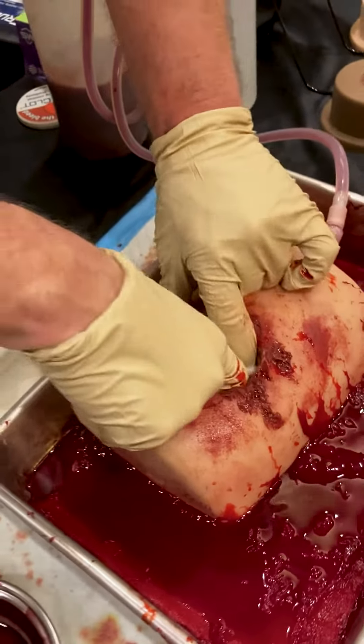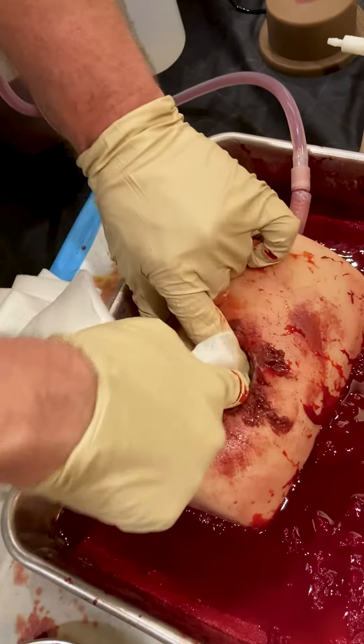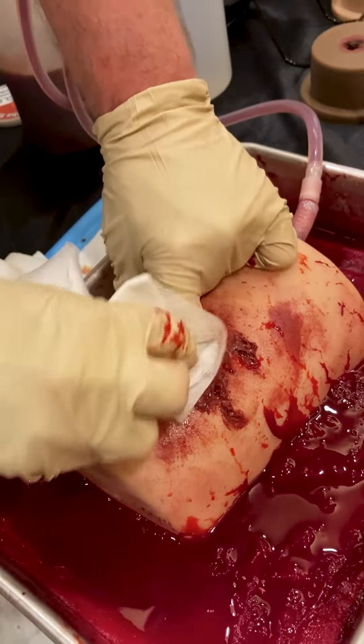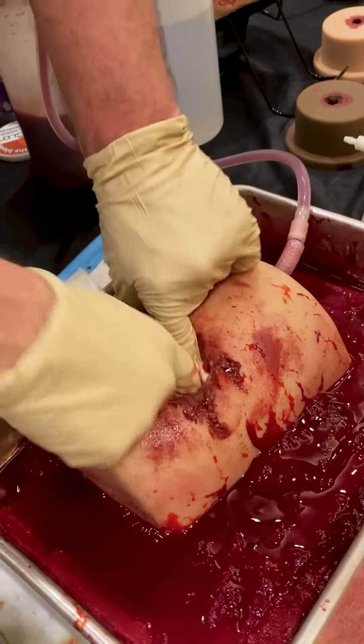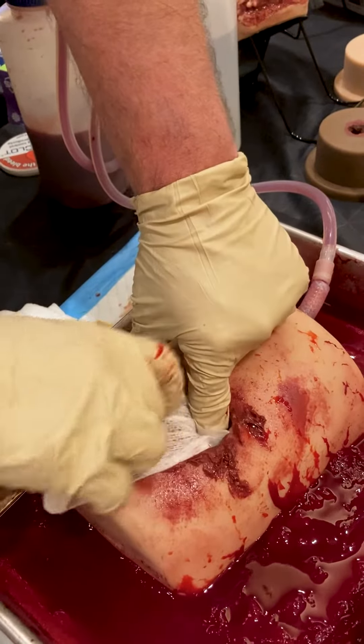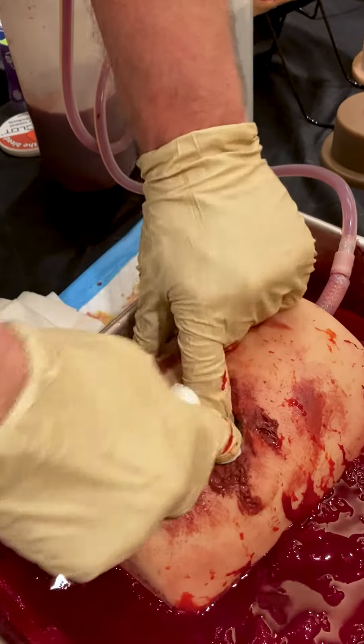Continuously pack. Notice I'm not pulling my fingers out — I'm trying to maintain constant pressure in there because that simulated femoral artery in there is like a garden hose. If I release pressure, we're going to get bleeding again. So obviously one pack was not enough, so I'm going to keep going until I can't pack anymore.